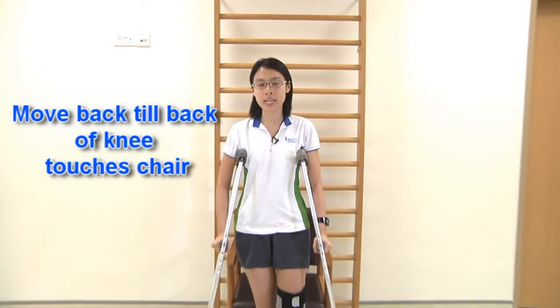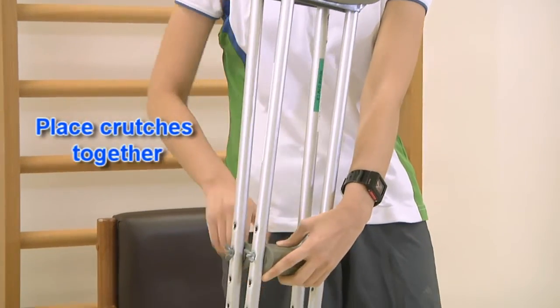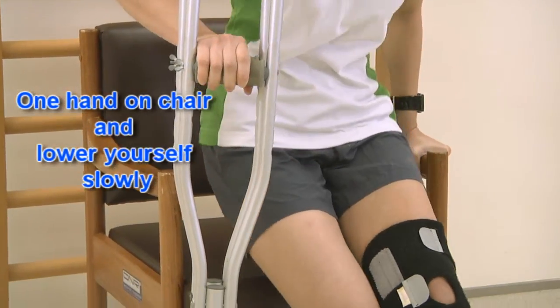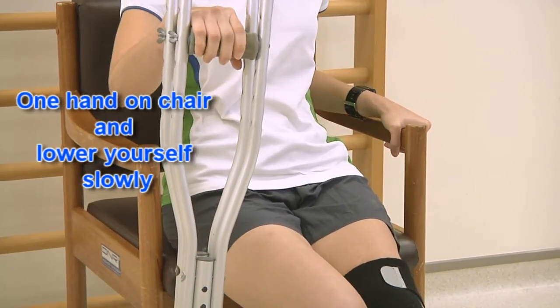To sit down, move close to the chair until the back of your knee touches the chair. Place both crutches together, have one hand on the chair and lower yourself down slowly.